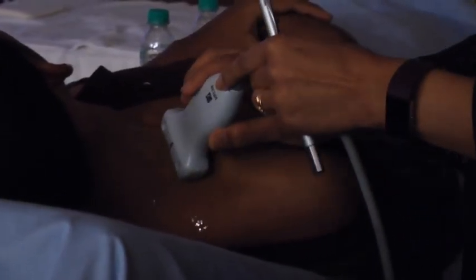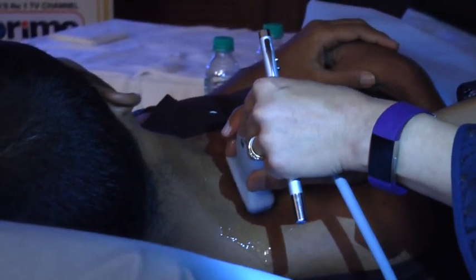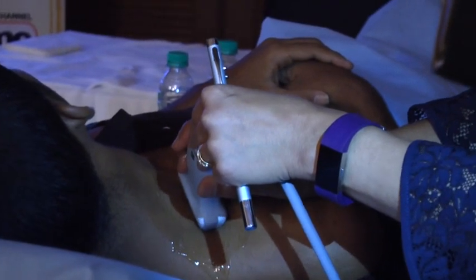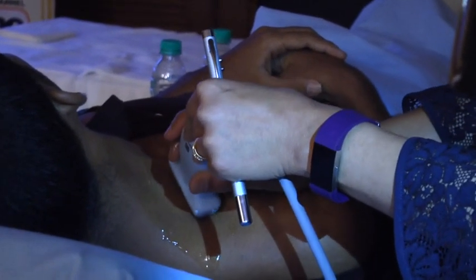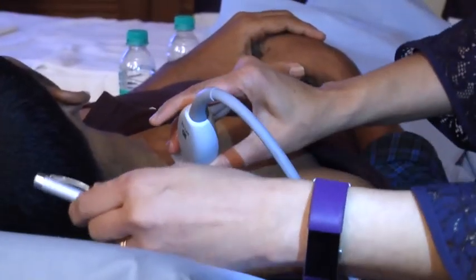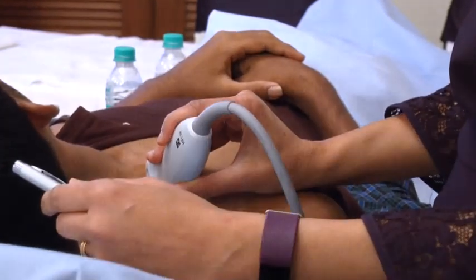Okay. So I'm just going to move on to the interscalene approach. So the various scanning methods which I spoke to you about before: you could start in the supraclavicular fossa and then track it cranially. So just keep your eyes focused on this nerve bundle.